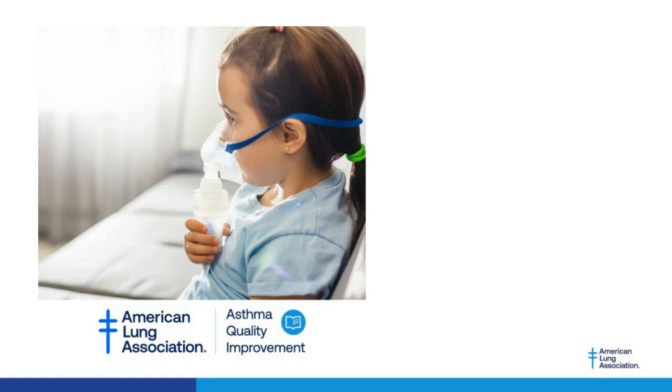I've been told by my infection prevention people and my infection prevention director that we treat everybody the same, as if they possibly have COVID. The American Thoracic Society went on about that too: we have a choice of testing everybody, requiring a test before we do spirometry, or not. Again, the American Thoracic Society says it's problematic either way. You should just treat everybody as though there's a possibility of COVID. A nice question. Thank you very much.